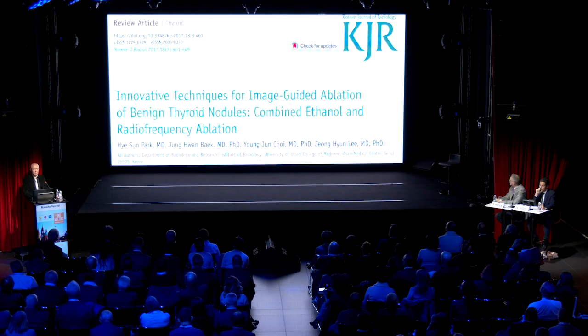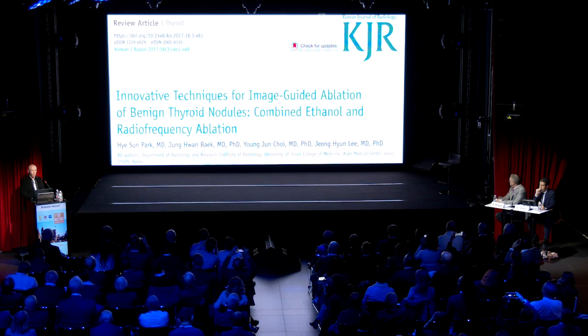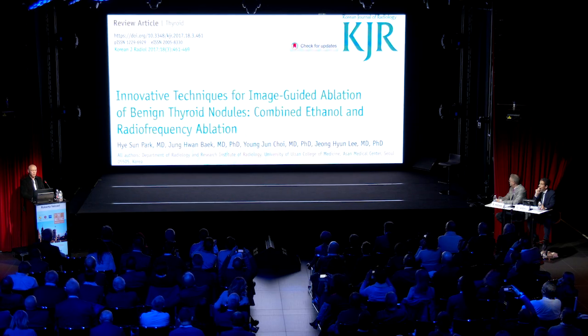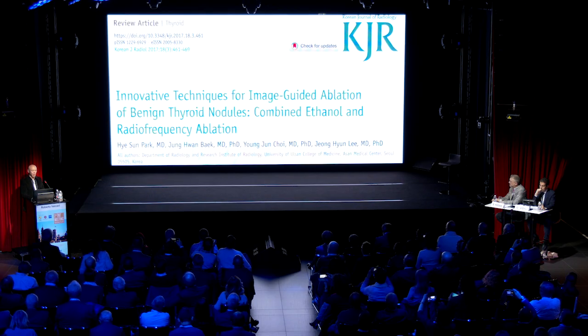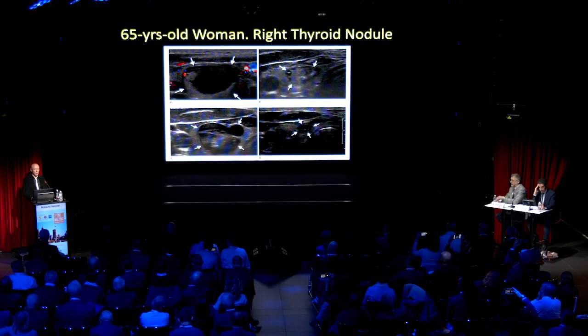And this is a paper published recently by Professor Baek and co-workers, who proposed the combination of ethanol ablation and radiofrequency. He reported two cases: a 65-year-old woman with a right thyroid nodule.